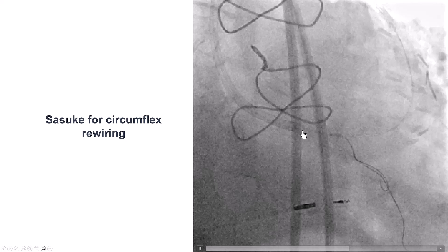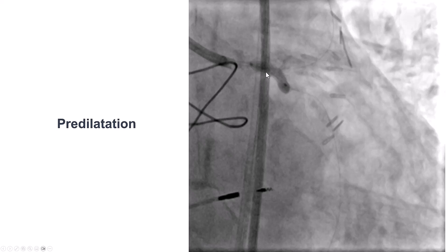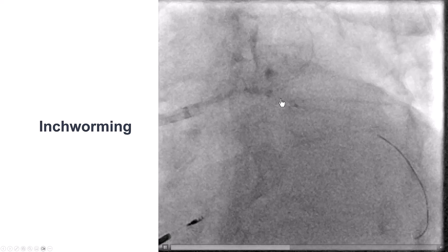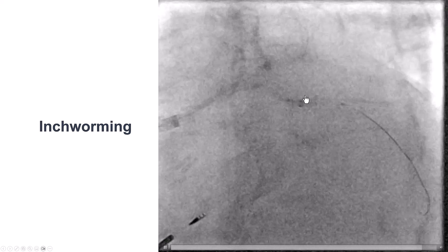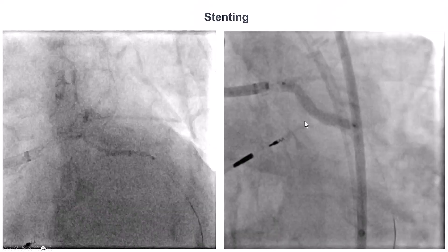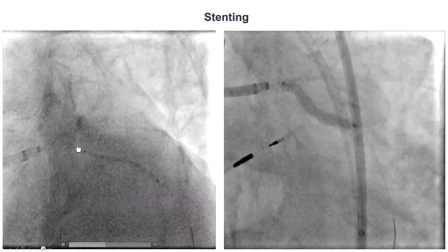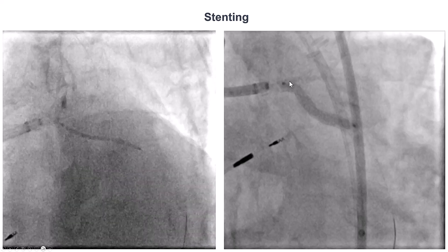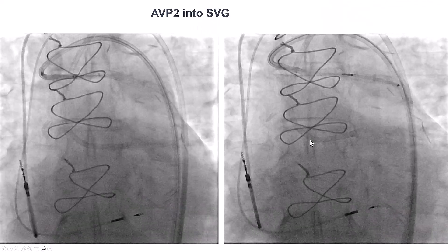Delivering equipment to the circumflex was extremely challenging. We used the Sasuke Dual Lumen catheter to advance a guide wire into the circumflex and then predilated, but had significant difficulty delivering any equipment through the calcium and the previous stent. So we used the inchworm technique — small balloon inflated, deflated, and the guide extension advanced during deflation. We were able to get the balloon into the circumflex, deliver the stent, and deploy it in a culotte fashion with the proximal part inside the left main and the distal part into the circumflex. We then rewired into the LAD and performed kissing balloon inflation with a nice result.